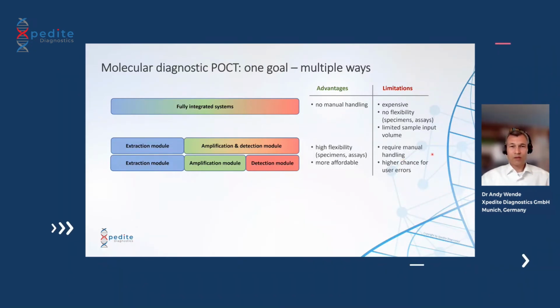But as usual, you also have some limitations, and the limitation here is you have to have some manual handling throughout the analysis procedure. So that means you cannot give this into the hands of any untrained person, but you have to provide a certain training, or you have to run these assays in the hands of people that are trained by education, for example. And since you have manual handling, you also have a higher chance for user errors.